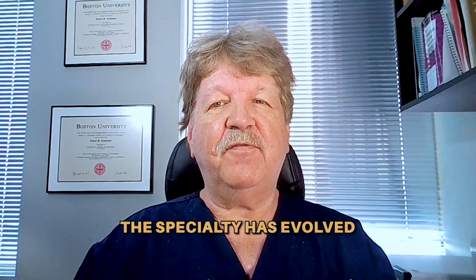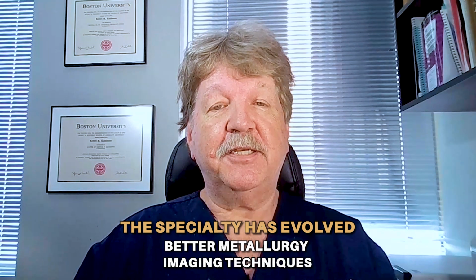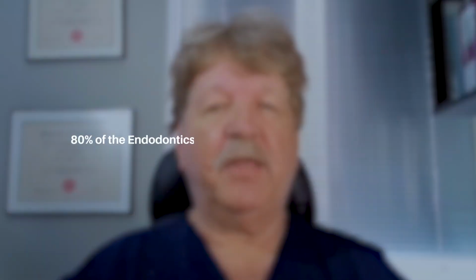The simple fact is this: the specialty has evolved. With better metallurgy and imaging techniques, it became possible to scale back the canal size. There are certainly many talented endodontic clinicians who can perform endodontics through these more restrictive accesses, but my concern is for the 80% of the endodontics that's performed by the general dentist.